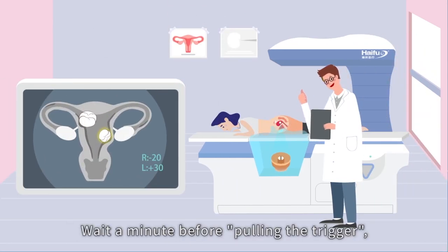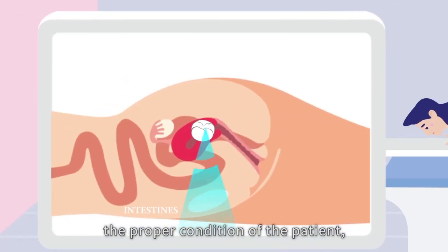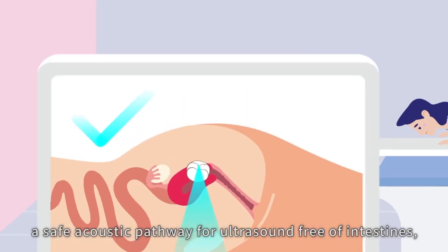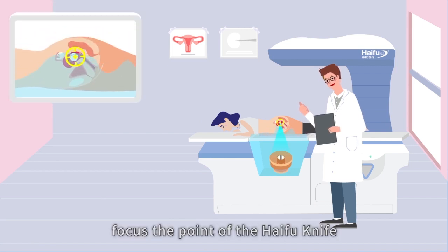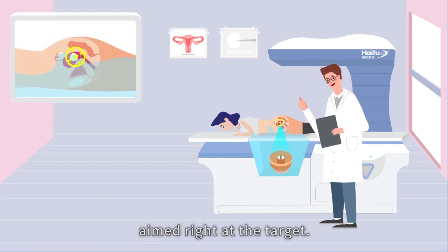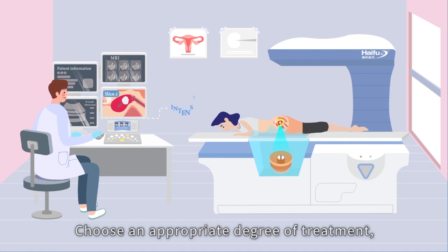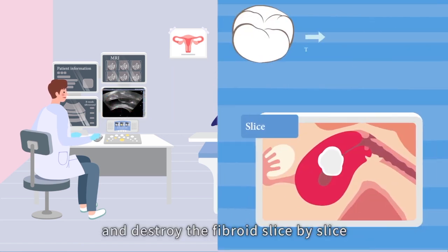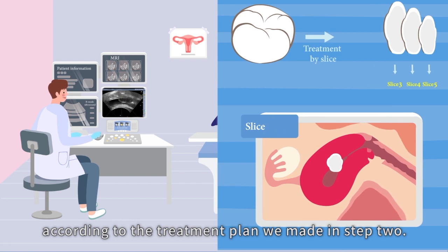Step four: treatment. Before pulling the trigger, we need to make sure of four things: the proper condition of the patient, a safe acoustic pathway for ultrasound free of intestines, a safe water level and temperature, and the focus point of the HIFU knife aimed right at the target. Now we can begin the treatment. Choose an appropriate degree of thermal power and destroy the fibroid slice by slice according to the treatment plan made in step two.